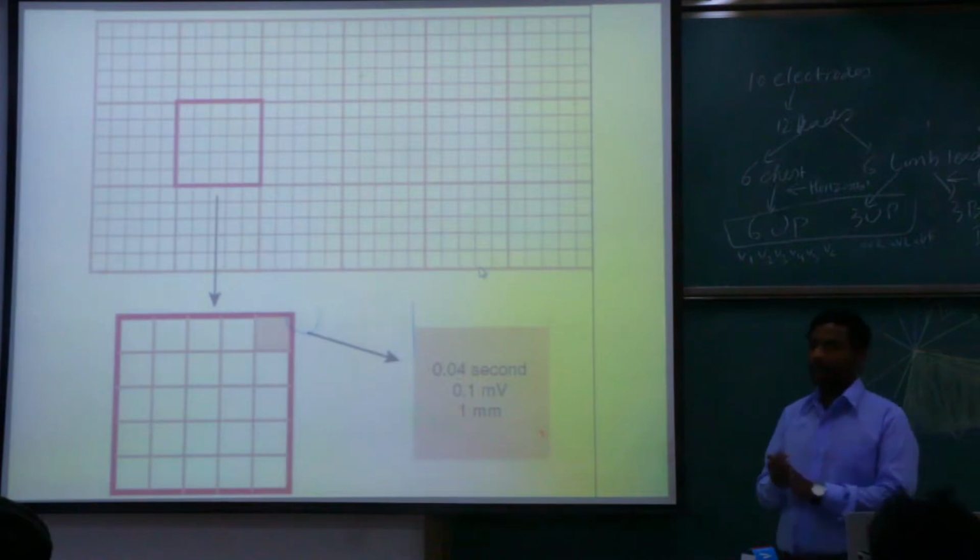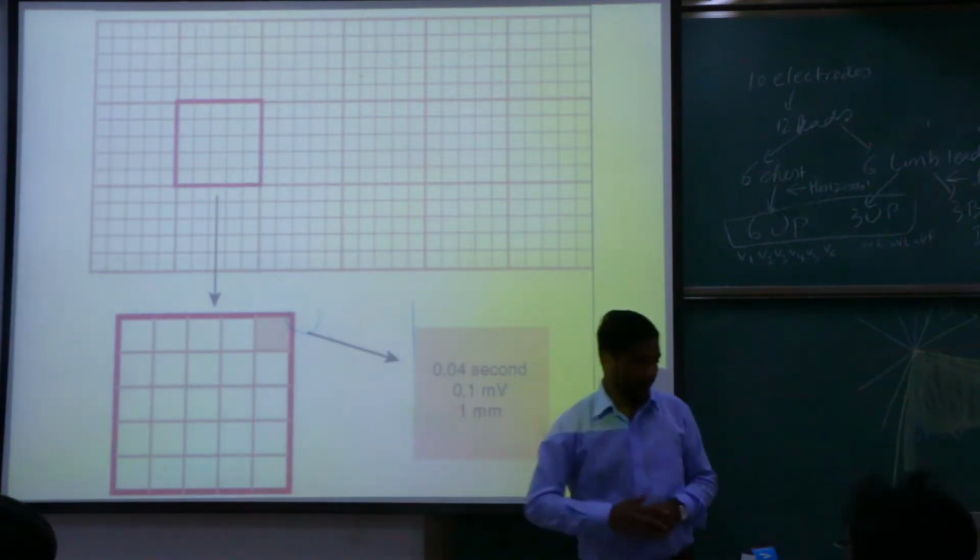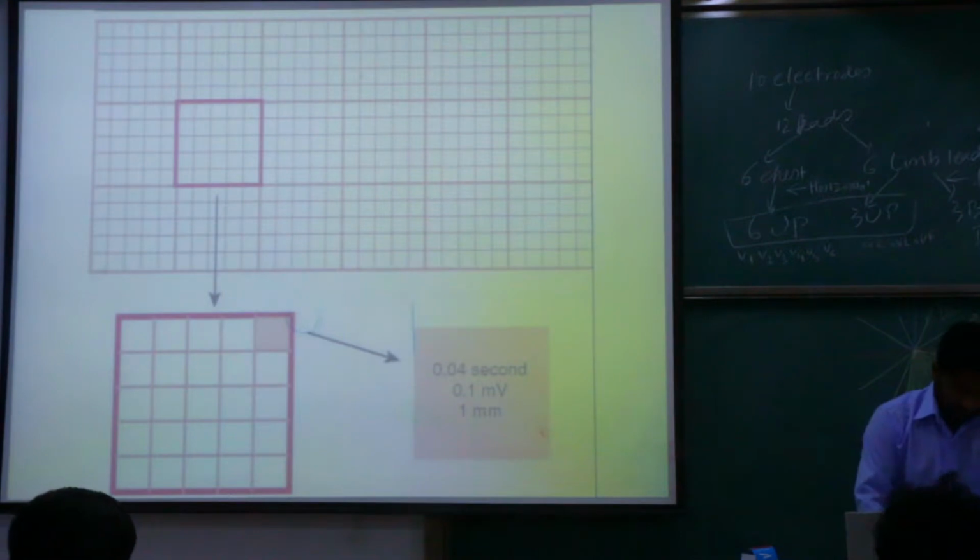Now, the next part of our class today is to learn about this ECG paper. Okay, so let's go for the ECG paper here.